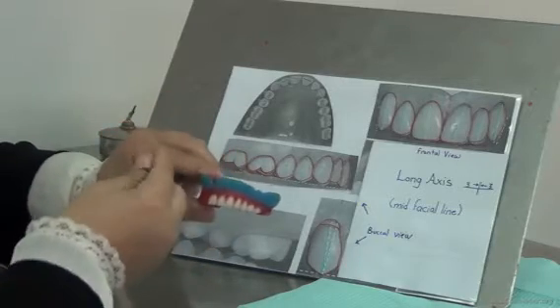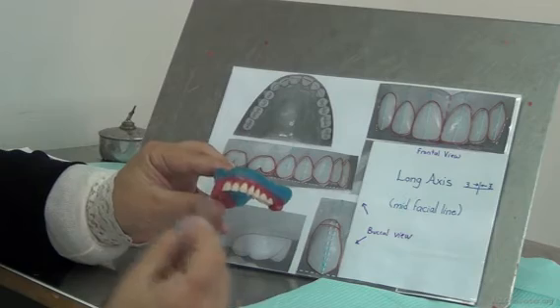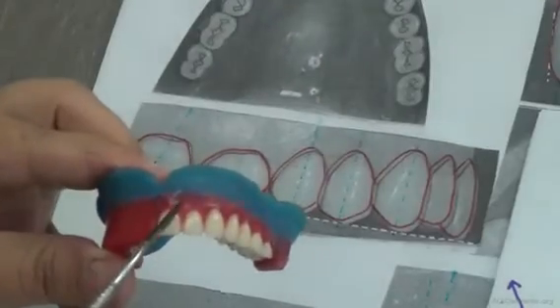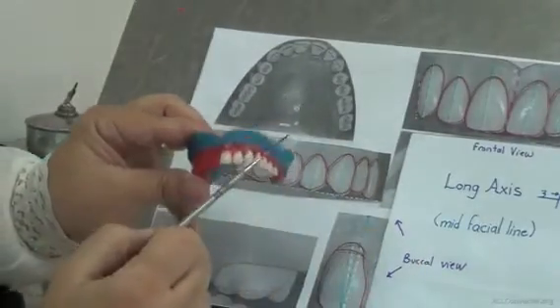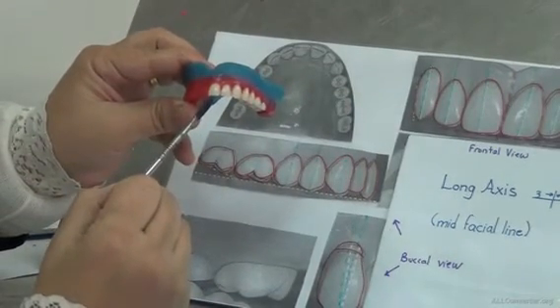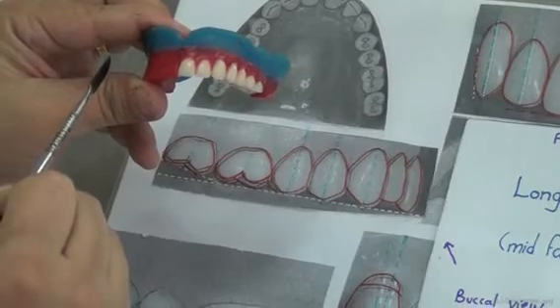Once we finalize which cusp is touching and not touching, we go back and check the angulation of teeth. For example, this central incisor can be touching while it's like this or like this or like this. So we need to look at the long axis. What is the long axis of the tooth? We also call it the midfacial line. It is the line bisecting the tooth. It goes from the middle of the incisal edge to the middle of the cervical outline of the crown, the clinical crown.